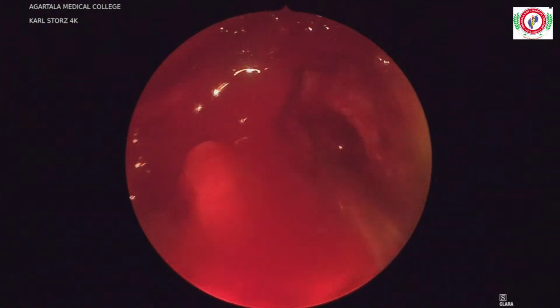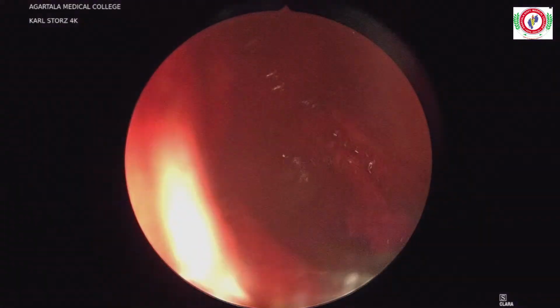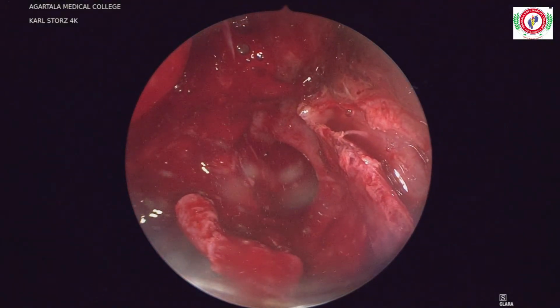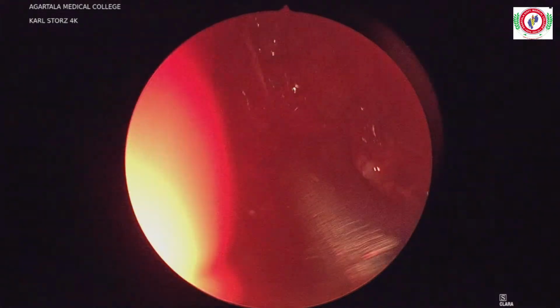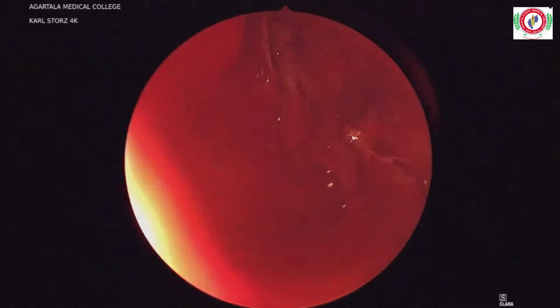Okay, so this was the tumor that was lying in the anterior part. So I think some bit of the tumor is still left. Now give me a wash. Let us clear it for everyone to see. Wash please. Wait. Clean.